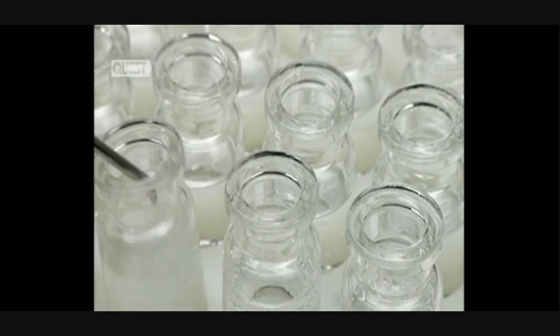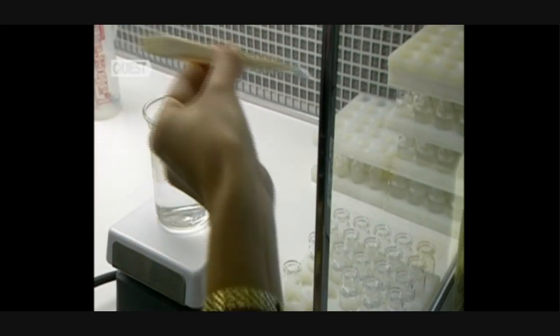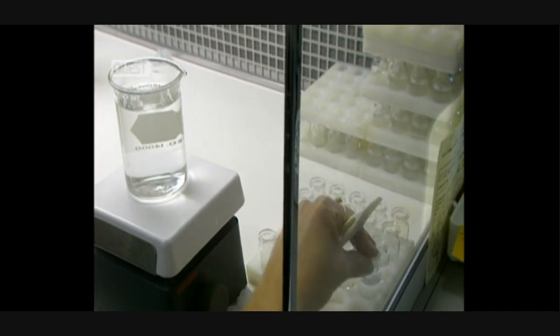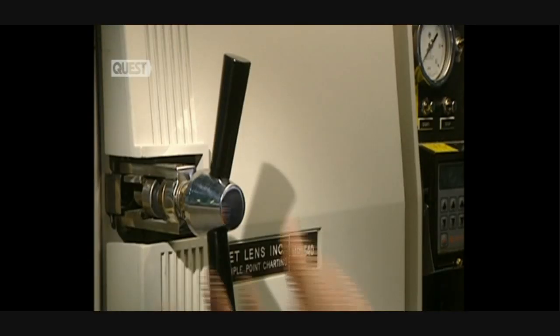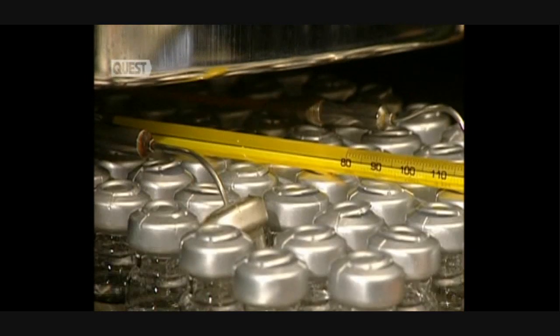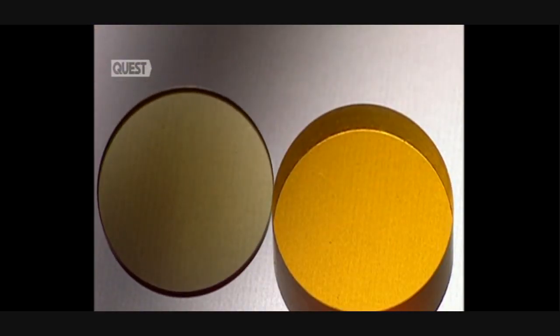Lenses are now completed, cleaned, and stored in containers filled with salt solution. The vials are perfectly sealed with a silicon cap and another of aluminium. They're then placed in a steriliser at a temperature of 121 degrees centigrade for an hour and a half. Amazingly, the contents will remain sterile for a period of up to seven years if not opened.